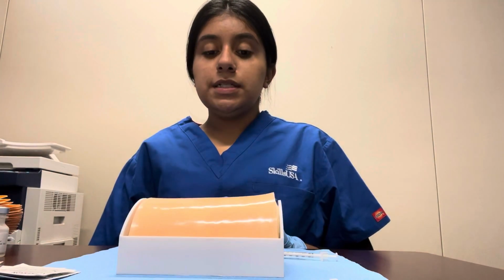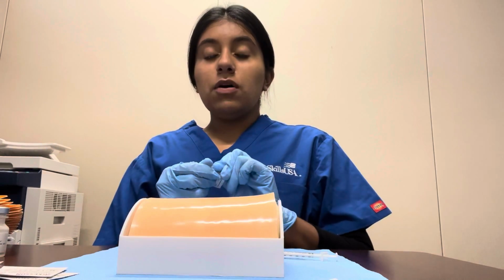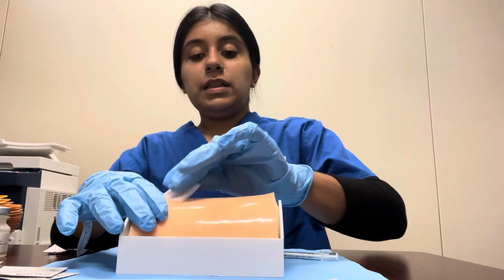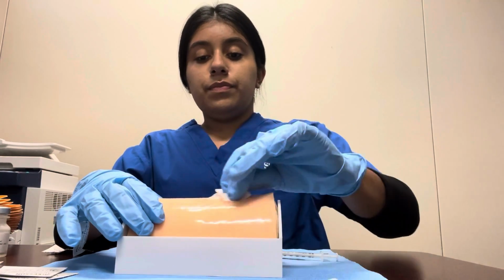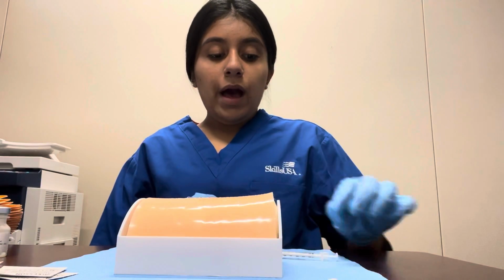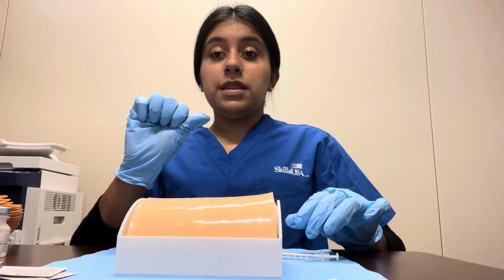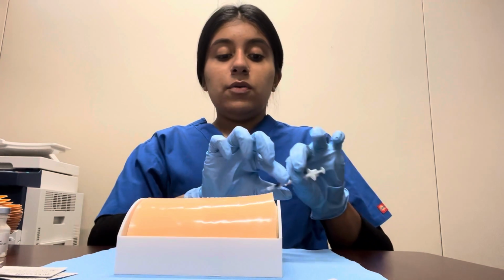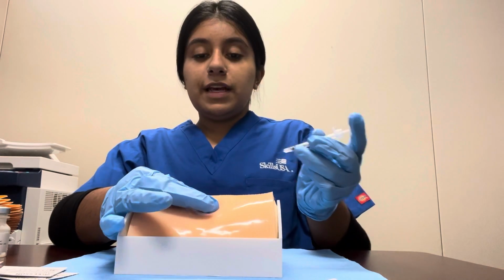Now that we have our insulin, I will go ahead and prep our patient. I will grab an alcohol prep pad and make sure to disinfect the area where I will be inserting the needle. I will now grab 2 inches of skin with my thumb and first finger, but we will now grab our needle as well as 2 inches of skin.